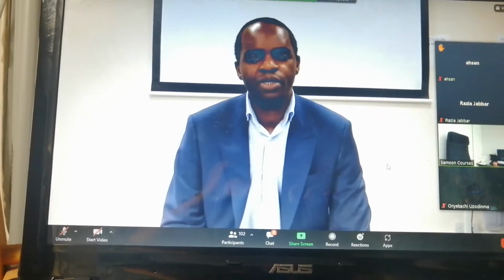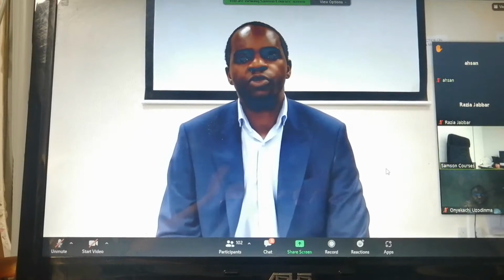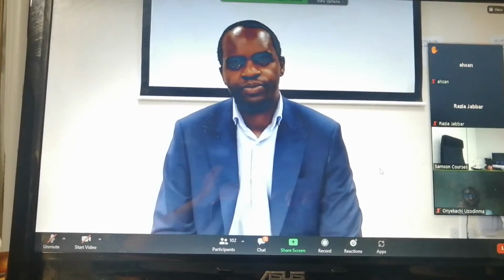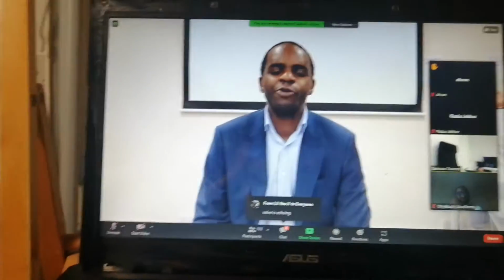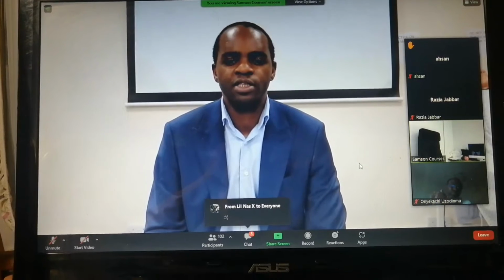She's happy and she's positive in the station. When you go and look in the station for the setup, there is a paper and a pen, obviously for you to draw and teach her about an ECG. The nurse is there, obviously wearing the blue top, which nurses usually wear. She's holding 4 ECGs in her hands. She may give you any of the ECGs, so you need to know how to read an ECG.